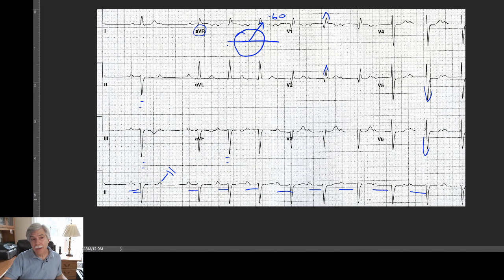I'm just trying to think of whether there are any other issues that I wanted to discuss. Well, it is, as I said, a kind of puzzling problem, and it's something to think about, but understanding the physiology is the most important thing when you're reading a cardiogram. It's not enough to just rely on pattern recognition and say, oh, left bundle branch, first degree, okay, trifascicular block, and then label it, because it may not be. And you have to think about why you're labeling it that way. Why would a trifascicular block cause the PR to become prolonged? Think of it this way.